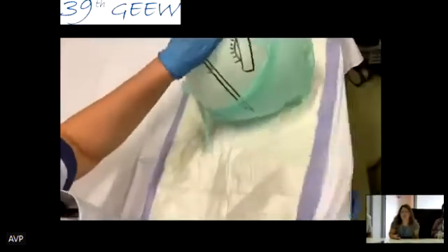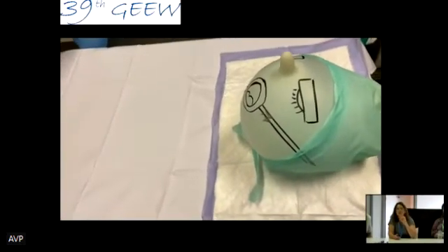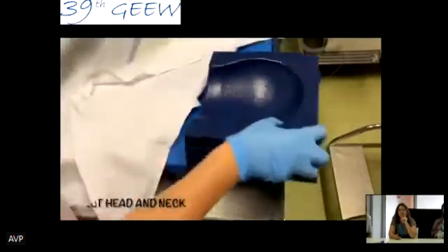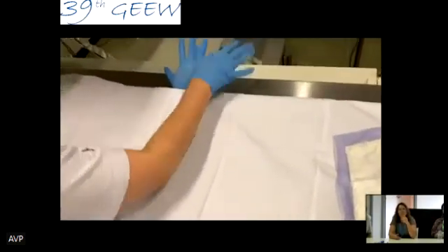We have all these different boxes, balloons, how do you call these? Yeah, pillows, to have the best position for the neck. Different types, so we have to see if it's on the side or in the supine position. This is better for the side. We have to take care that there is no compression.